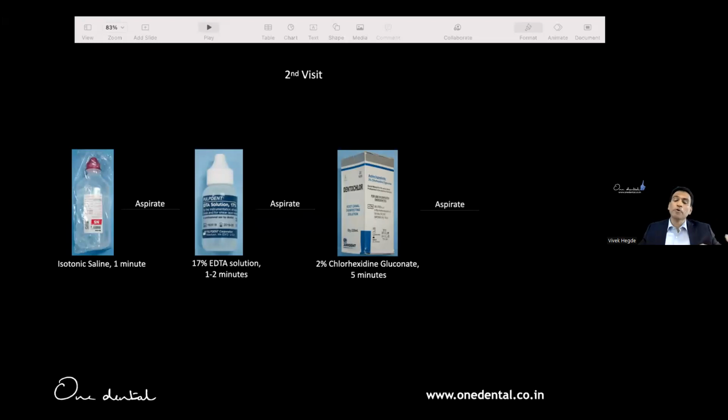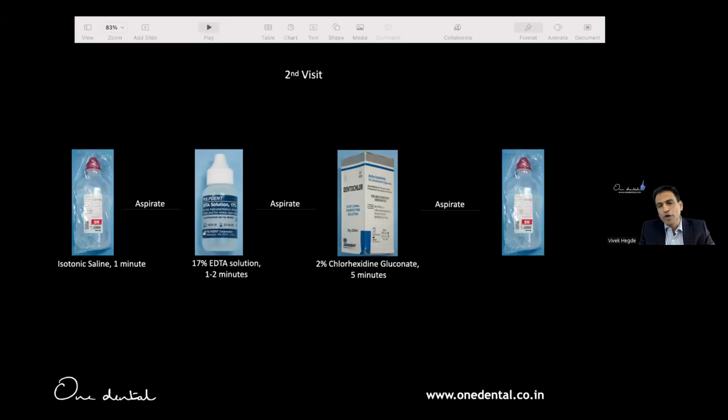Some said, can I leave chlorhexidine for a longer time? I would say no, because it can interfere with the sealer. There are interactions of this with sealer or calcium hydroxides. So wash it out. For me, saline or distilled water becomes my final rinse. And then I dry with paper points. Then we go with obturation.